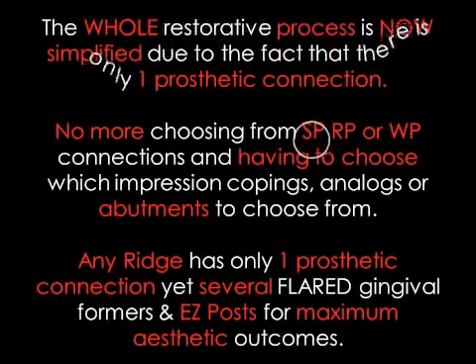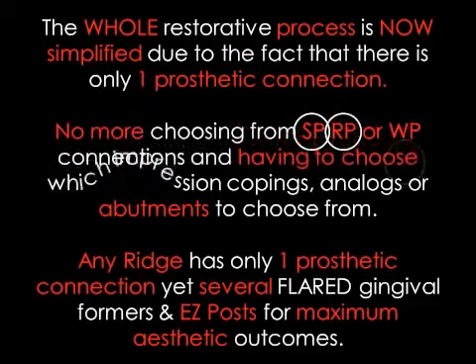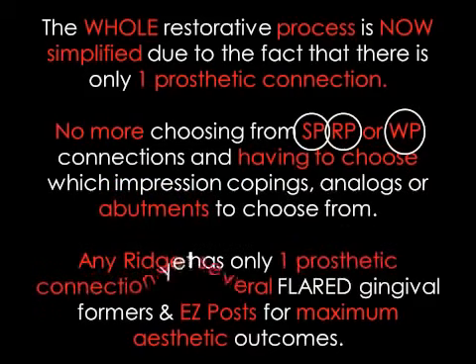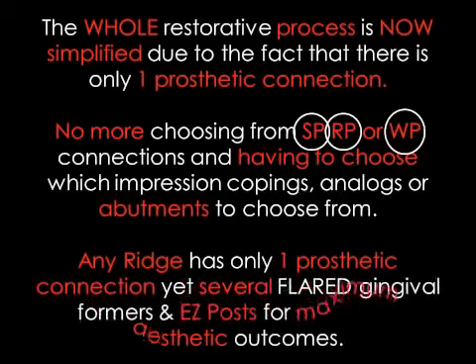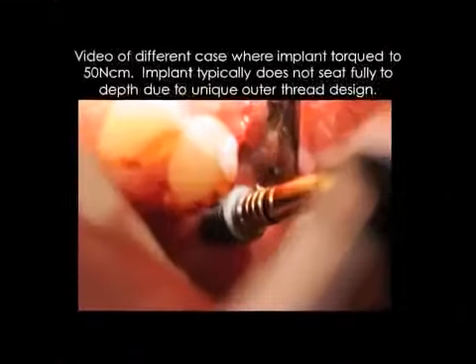One thing I cannot stress enough is I was a dental assistant for 13 years and had to keep stock of many different implant systems. Having one prosthetic table will definitely save you a lot of money and time in dealing with no more small platform, regular platform, wide platform.